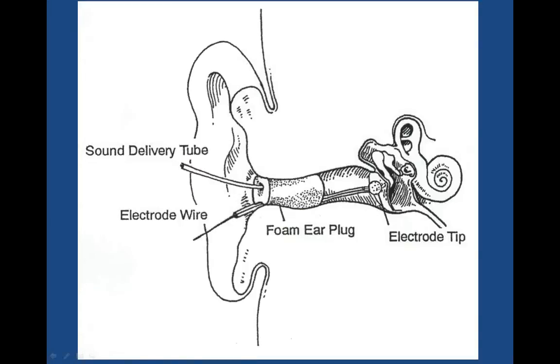And it's hard to see into that to see if it is touching. So my key is the patient acknowledges that it's touching the eardrum. I then use the EAR earplug tip here, and generally what I do is I cut them in half. That makes them a little smaller. I compress it, I stick it into the ear canal, it expands, and it actually holds the electrode in place and does a good job of it.